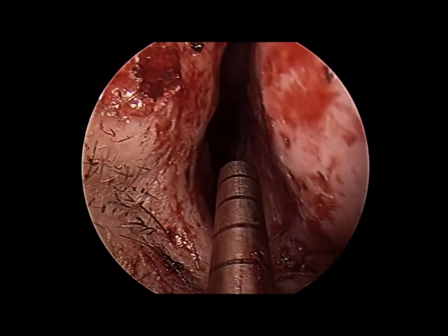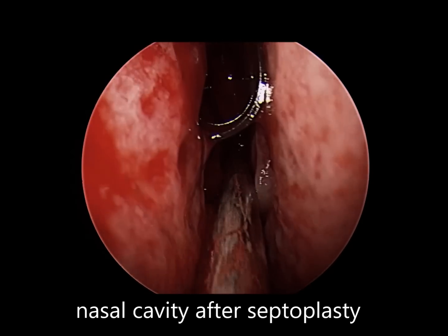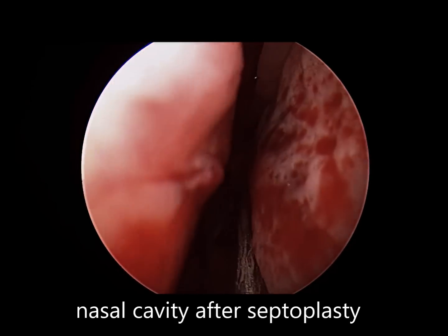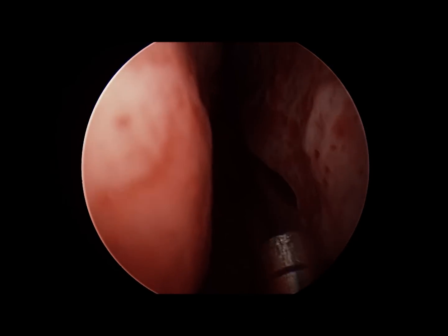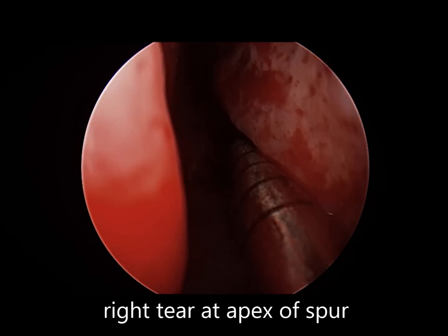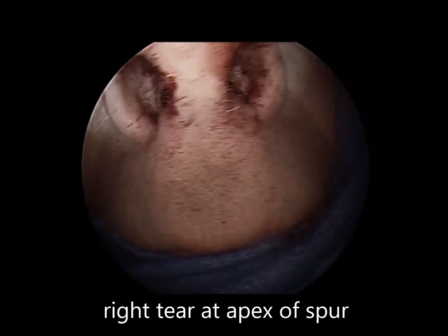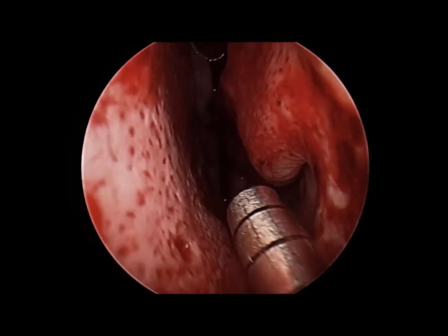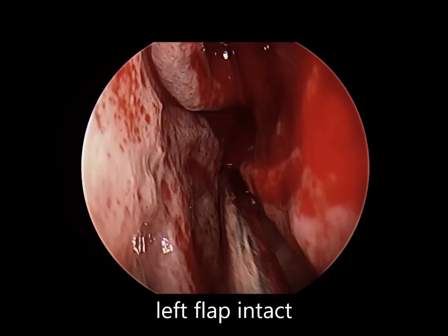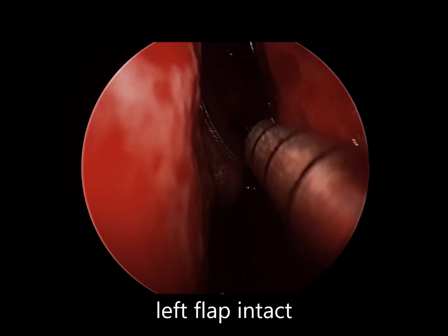We will then inspect the nasal cavity to ensure that we have the septum straightened out. In this case, the patient has had sinus surgery as well, and you saw gel film rolled up above. This patient had a very prominent spur towards the right side, and therefore they do have a tear at the apex of that spur, which is completely expected. We're very careful then to make sure our flap on the opposite side is completely intact and that there is no tear, so as to avoid any perforation.